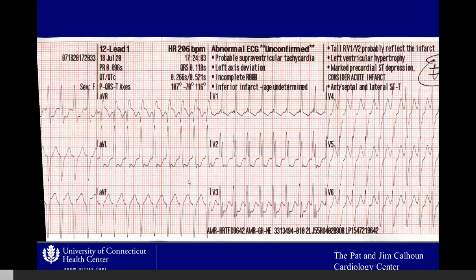This is an idiopathic VT using part of your conduction system. So it's a Belhassen ventricular tachycardia. There are 3 different morphologies of idiopathic ventricular tachycardia using your conduction system, and that is the most common form that you see in 80 to 90% of the cases. So you have left axis deviation and a right bundle branch block morphology, and typically, in some leads at least, these tachycardias are relatively narrow, while in other leads you see a little bit more wide. If you use part of your conduction system, these tachycardias tend to be fairly narrow.